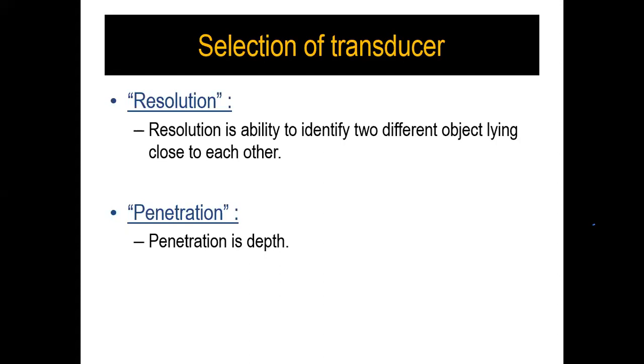On the other hand, penetration. What is penetration? Penetration is depth. If I'm scanning a child or a neonate who has hardly any chest muscle mass, we don't need much penetration, versus an adult who has significant muscle mass between the point of interrogation and the point of evaluation.